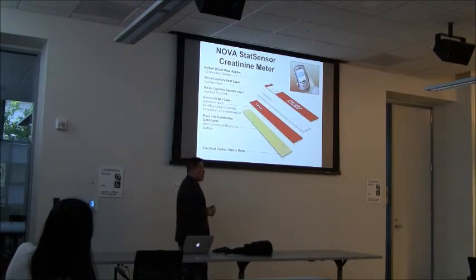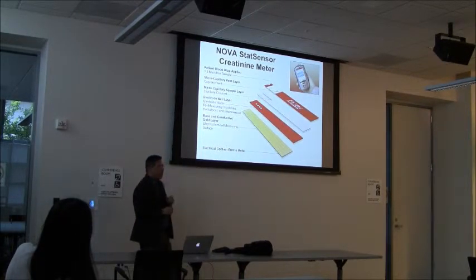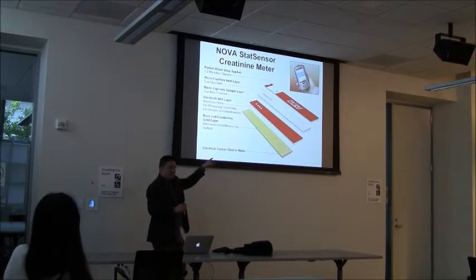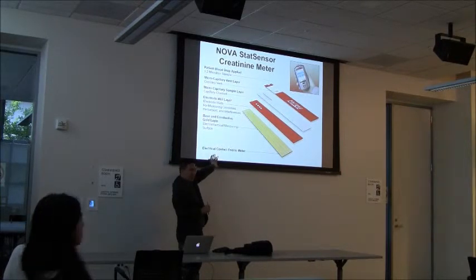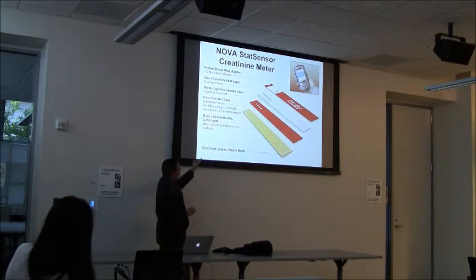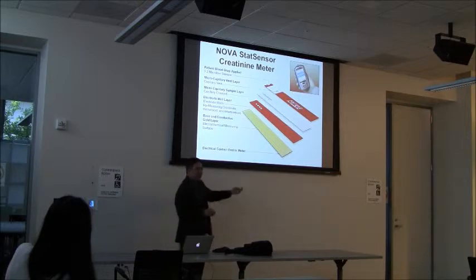In a patient with lots of red blood cells, for whatever reason, because you're dehydrated, you have a high red blood cell count, what's called hematocrit, you're going to have the issue of mechanical impedance of the molecules getting to the sensor. So without some sort of correction, your devices will potentially read artificially lower. Does that make sense? Less glucose getting to the sensor. How the sensor works is that there are enzymes here that generate a redox reaction, and then the electrons move towards the electrode and generate the current. It's an amperometric sensor. That's how it measures it.